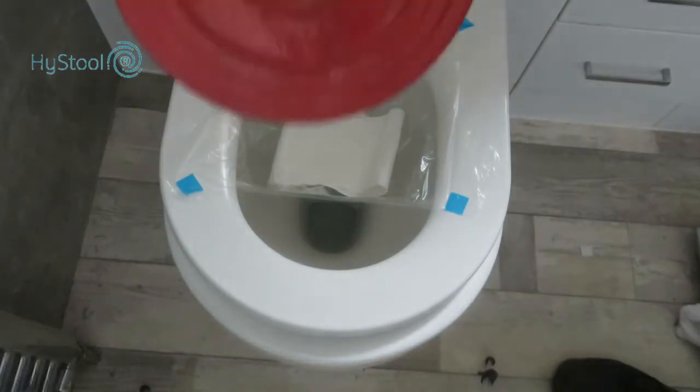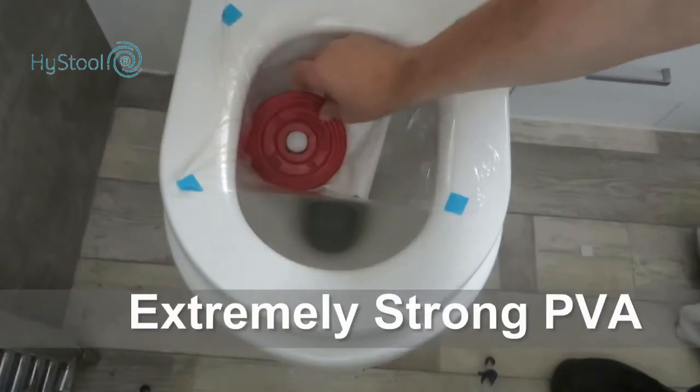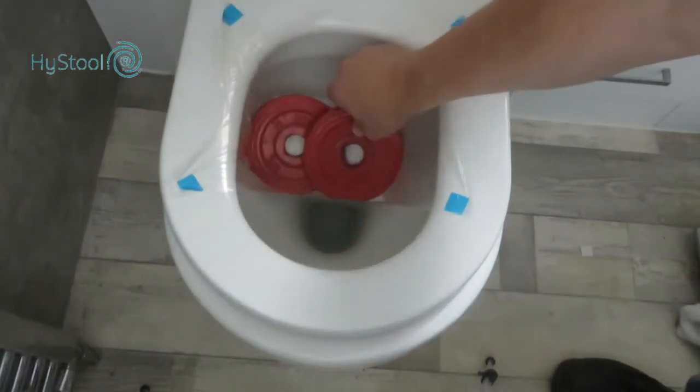High Stool bags are made from PVA film which is extremely strong and lightweight. In this test we place two 1kg weights into a bag that has just been attached to the toilet seat.